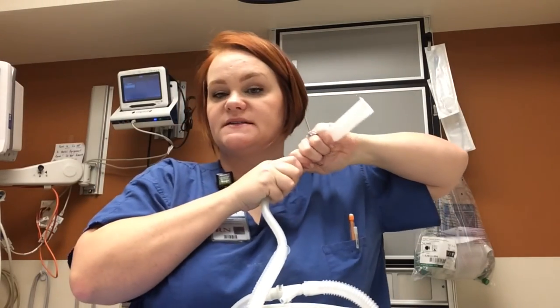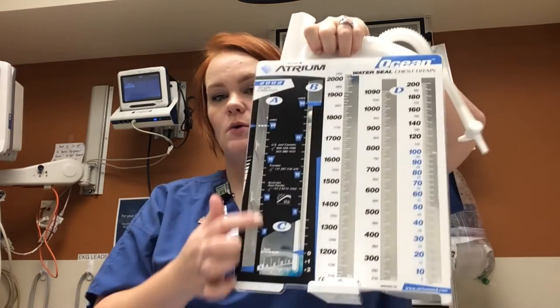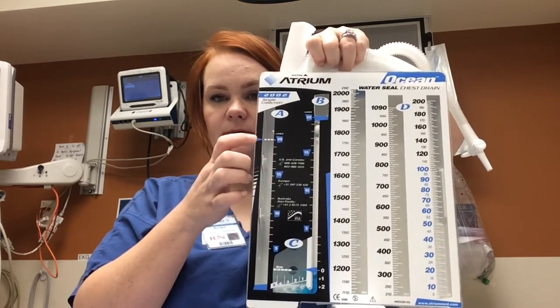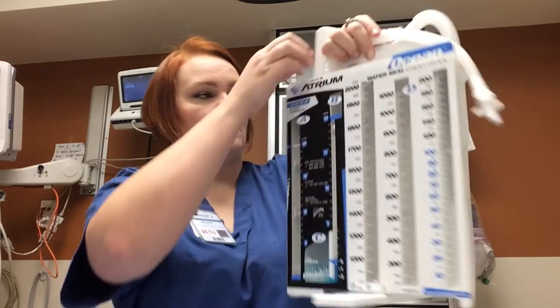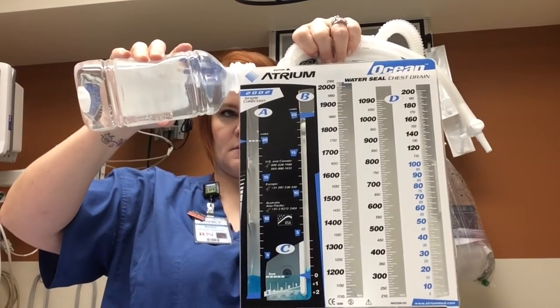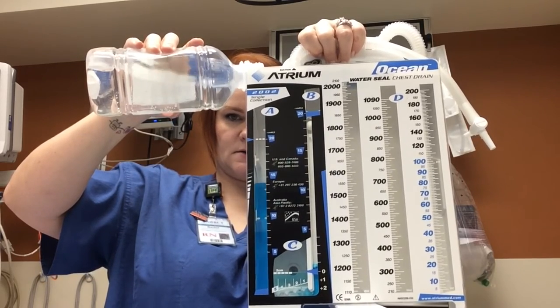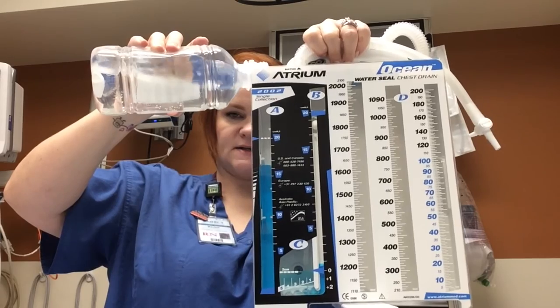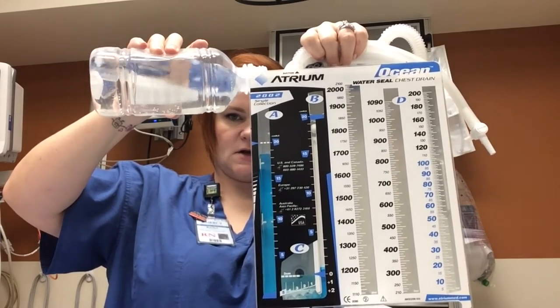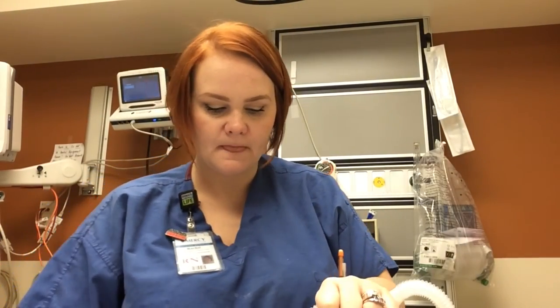You pull this piece off because this goes to your suction. You can either use this device to fill up your water suction chamber, or right here that we filled to 20 centimeters, or you can just pour the saline. It's certainly up to you, however you want to do it. So I'm going to go ahead and pour this up. And again, we only want it to 20, because the more water suction that we have in there, the greater suction that it's going to cause to the chest. So once it's right there, go ahead and stop, and then replace your cap.